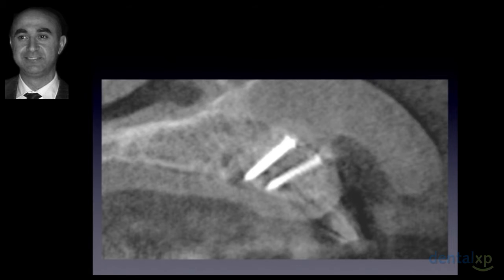And you can see the amount of bone that we have achieved from a labiopalatal perspective. These were the fixation screws from BioHorizons, around 9 millimeters in length.